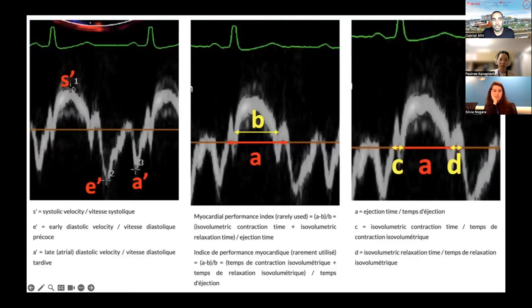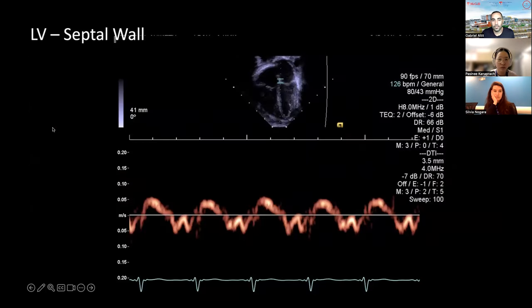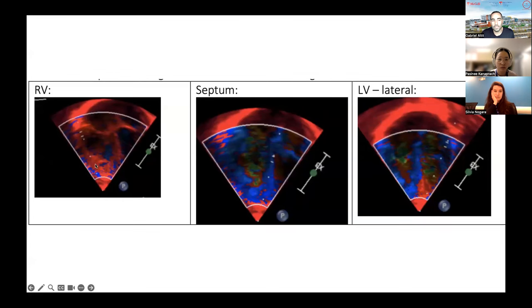And so it's typically used in the apical view. You see that's the apex, this is the right ventricle, this is the septum, and this is the left ventricle. And you can see here, actually, my angle is very high. The wall is moving up and down here, and my angle is going up to here. So I have at least 30 degrees. It's probably acceptable, but I find it to be a bit high if I criticize myself.